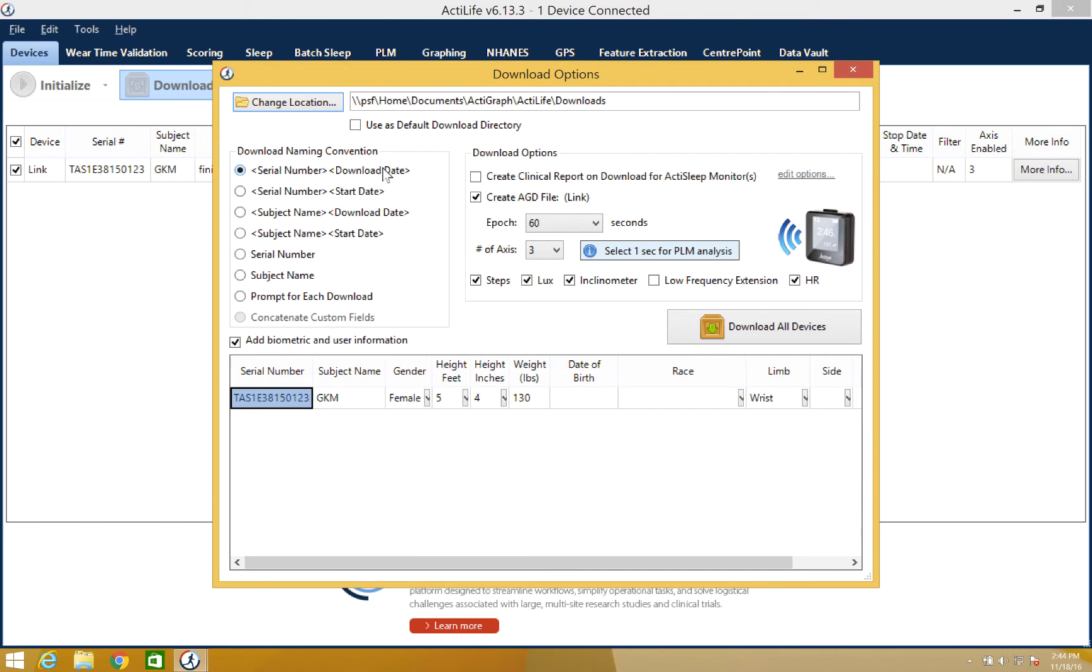The download naming convention box will allow you to name this new data set based on information already located on the device. These options include serial number, subject name, as well as other additional options.